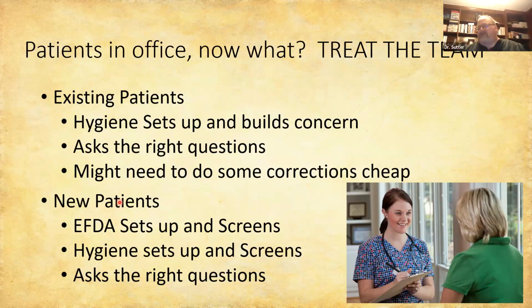If you see something crazy like 35% of total bite force on one tooth, follow up with the question, hey, have you had any new dentistry lately? And they're like, yeah, I just had a crown placed, and I'm here in your office because it just doesn't fit right. Or, yeah, I had a wisdom tooth taken out that was really hurting, and now I feel my bite's changed. It's great to get some feedback from the patient.